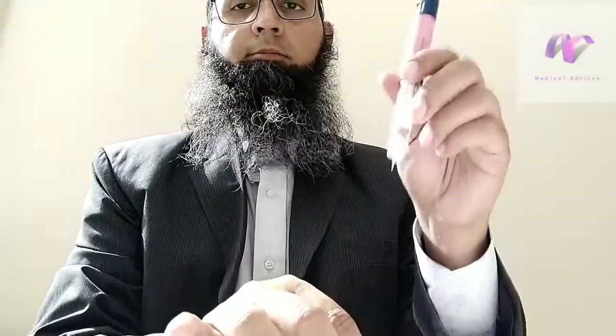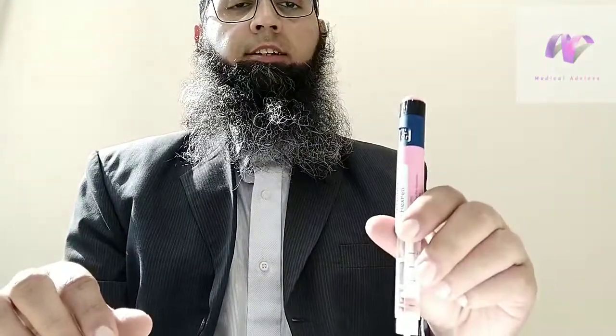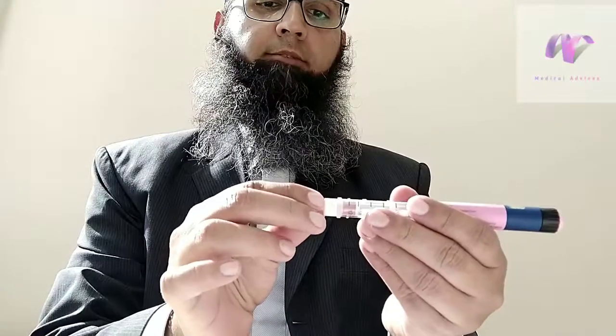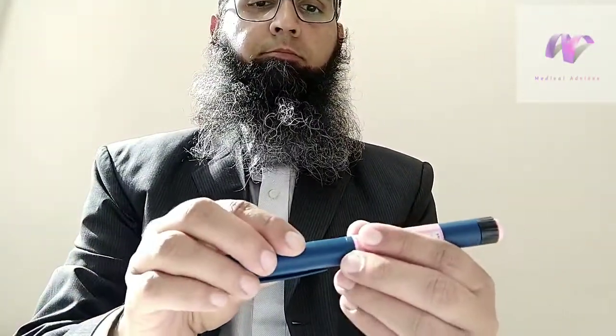While you're administering the insulin to the injection site, you can even hold a pinch of skin or subcutaneous tissue or fat to insert into the area, or you can insert it as it is. Once you're done with it, you first need to cap the needle, remove the needle, and then you can place the insulin in a cool and dry place.